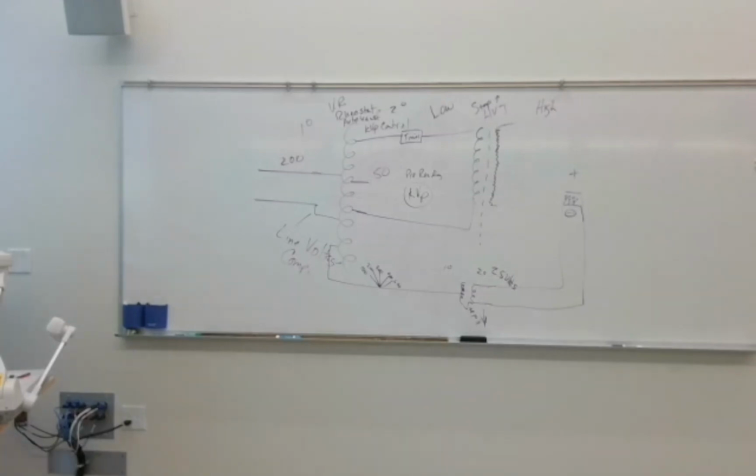Okay, so a couple of things then. If you look on page 99, you'll see a correction circuit has to be incorporated to counteract the space charge effect. And that is, as the KVP is raised, the anode becomes more attractive to the electron stream that would not have enough energy to leave the filament. These electrons join the electron stream, which effectively increases the MA with KVP.